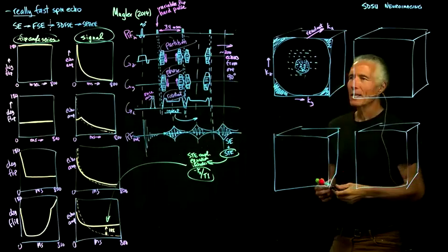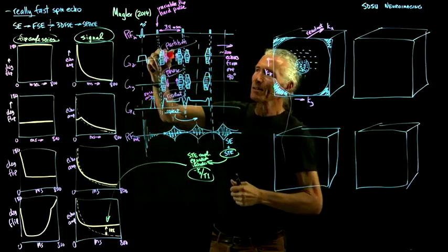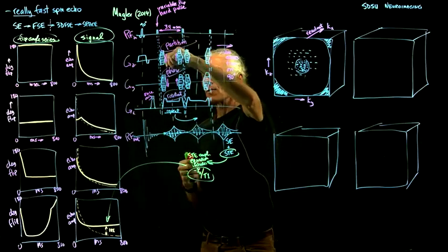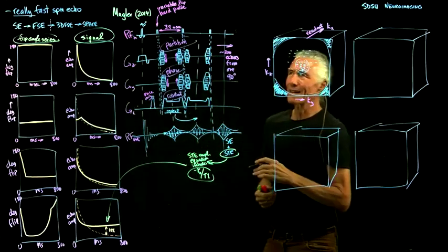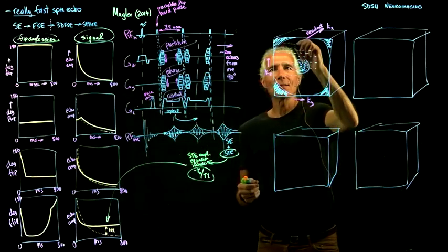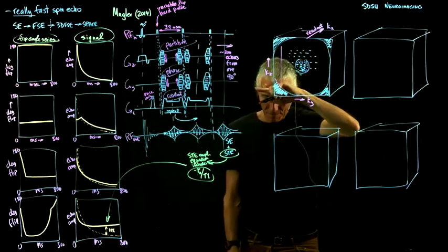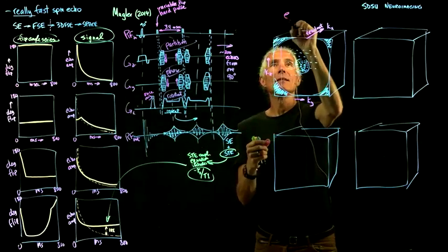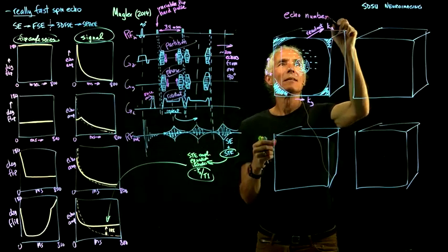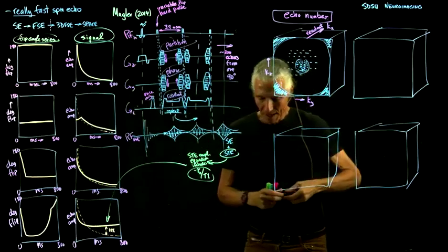And then do like a tricky method. So like the way I've drawn it here, for this setting of the Z gradient, do all of these ones of the Y gradient, but that takes a little more time. So let's do it in a trickier way. And so if we look at each of the echoes, so these are sort of the echo number here. So where are the different echo numbers happening? They're happening as you go across KY.